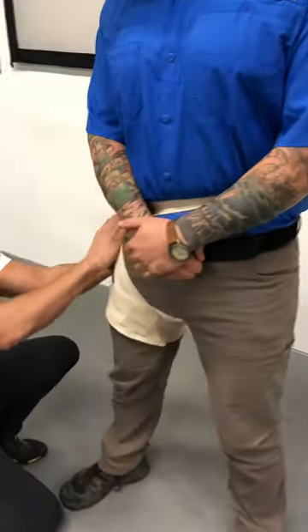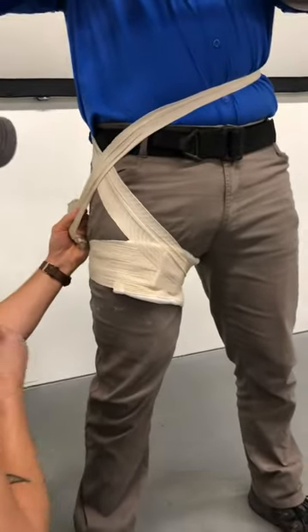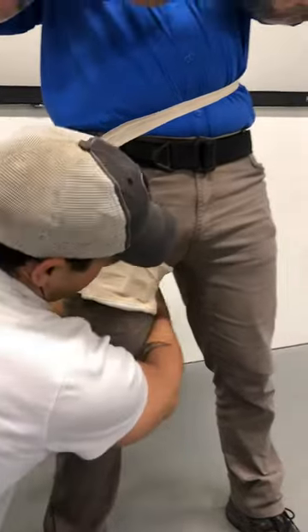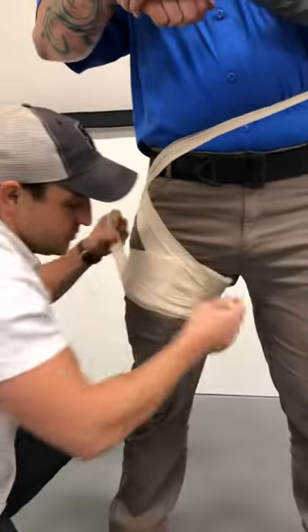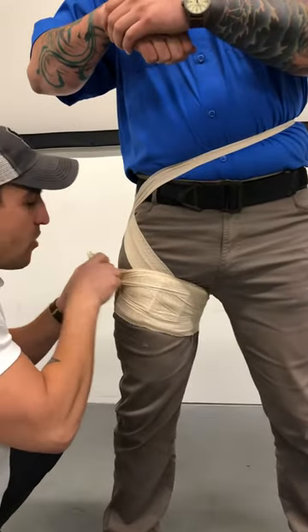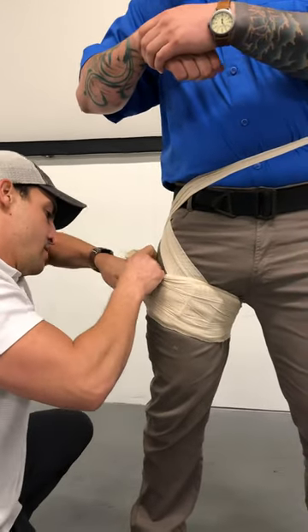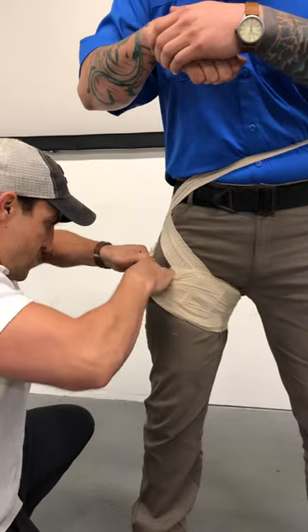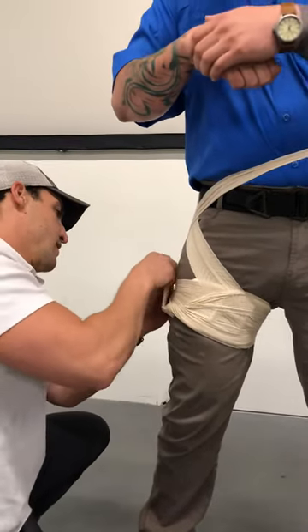Now on this side right here, you're going to end up having an X as well, similar to the one for the axillary bleed. Now we're going to come around here again, start wrapping distal to proximal, covering up all the white in the process, tucking this through and clipping it in.